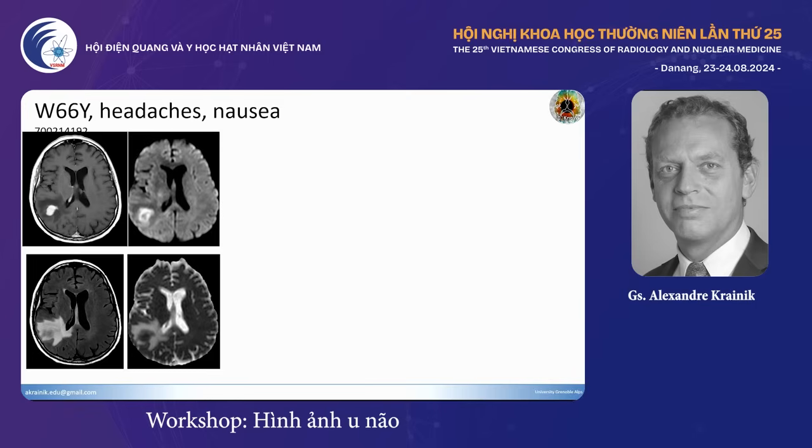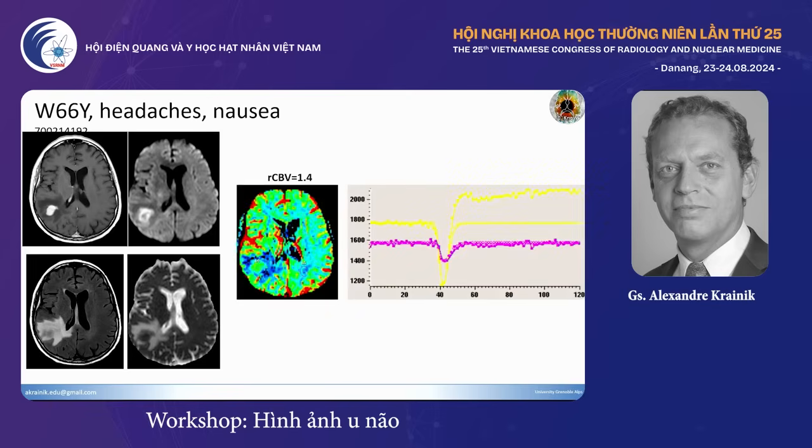It's exactly like when you're in a train station on a Saturday afternoon, you're going to have difficulties moving along because there are too many people. It's not necrosis. I'm not talking about necrosis. I'm only talking about the cellular content of this tissue part. Then, the very high cellularity in this lesion. You do the perfusion and you see there's no real hyperperfusion, although there was a nice leakage, and this is typical of lymphoma.